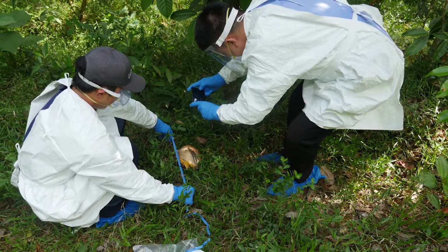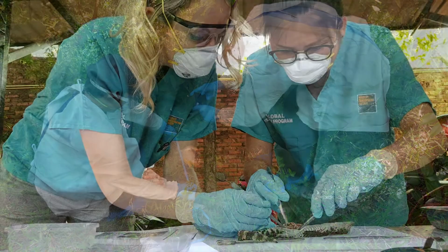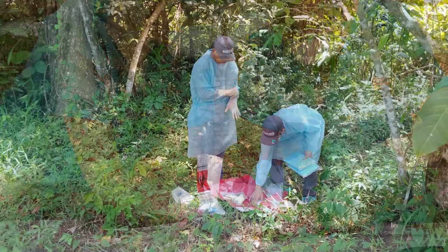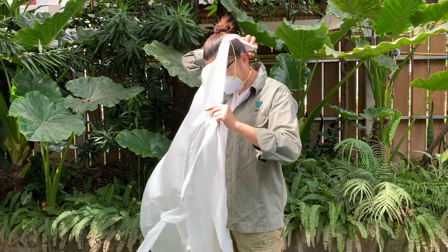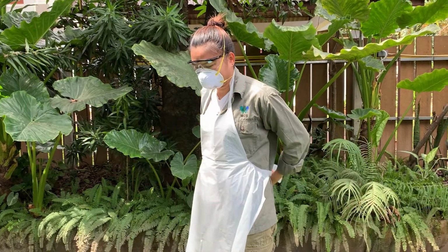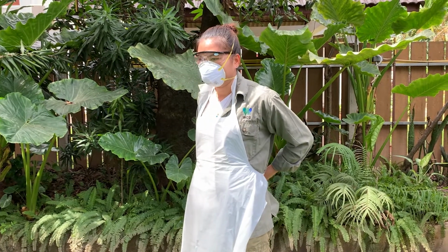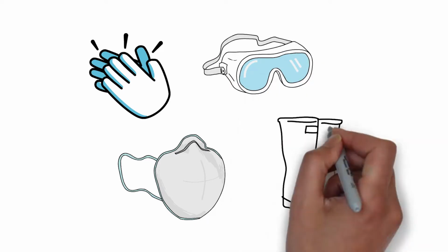While collecting information and samples, your primary goal should be cleanliness and safety. Collecting samples in a clean manner facilitates proper diagnostics and minimizes both sample contamination and personal exposure. Before approaching a sick or dead animal, protect yourself first. All team members must wear personal protective equipment when approaching a sick or dead animal. This may include gloves, a face mask, eye protection, and designated clothing.